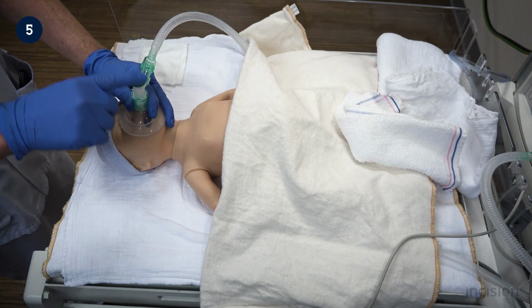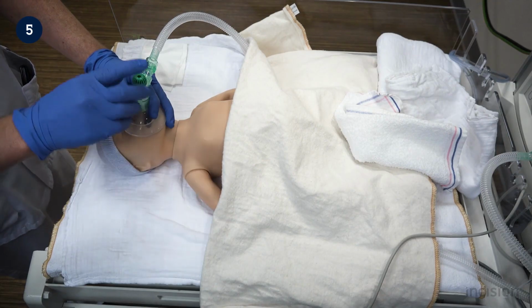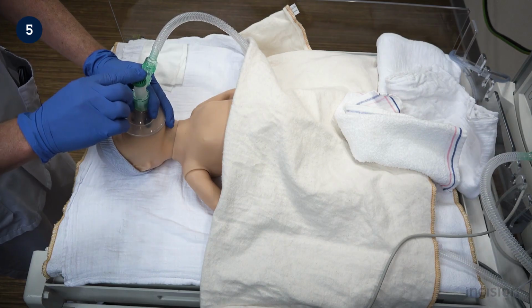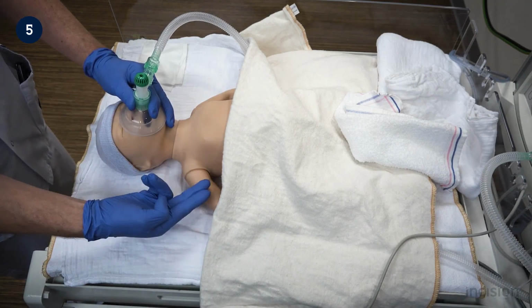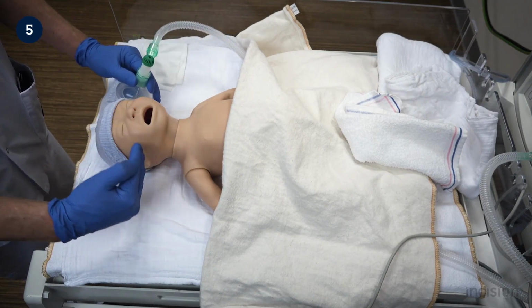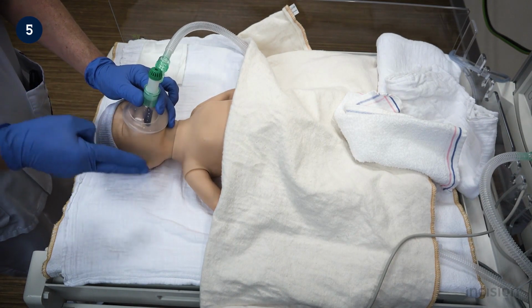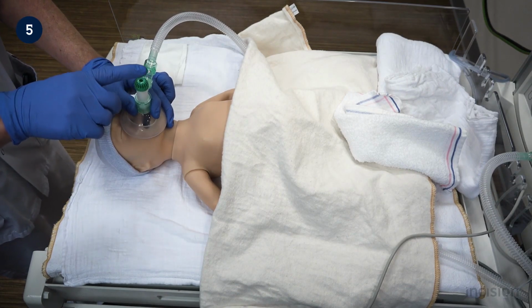Please note, however, that over the first 1 to 3 breaths, the chest may not be seen to move due to the presence of fluid in the alveoli. In the event that chest expansion is not seen on inflation of the neonatal lungs, the following factors should be considered. Is the airway open? Is the head in a neutral position? Is there an obstruction of the oropharynx or trachea? Is there leakage of air from the face mask seal? Is the inflation time correct, 2 to 3 seconds?